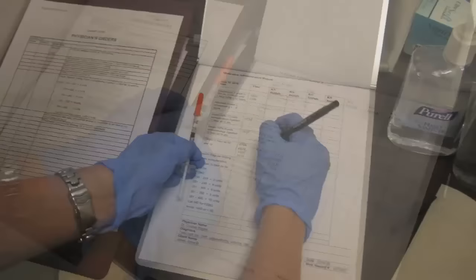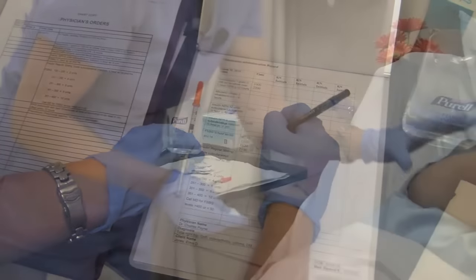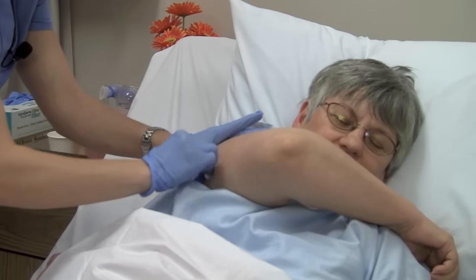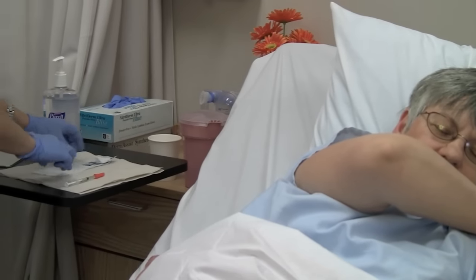Compare the MAR to the medication to be given. Wipe the injection site with an alcohol swab and let the skin dry. We'll let that alcohol dry and I'll give you your injection in just a moment.